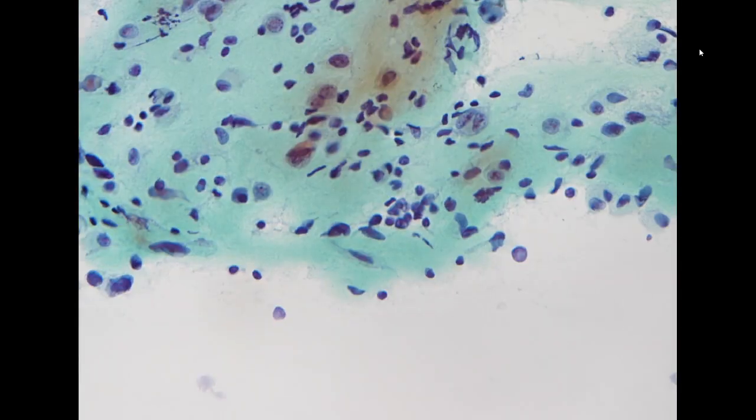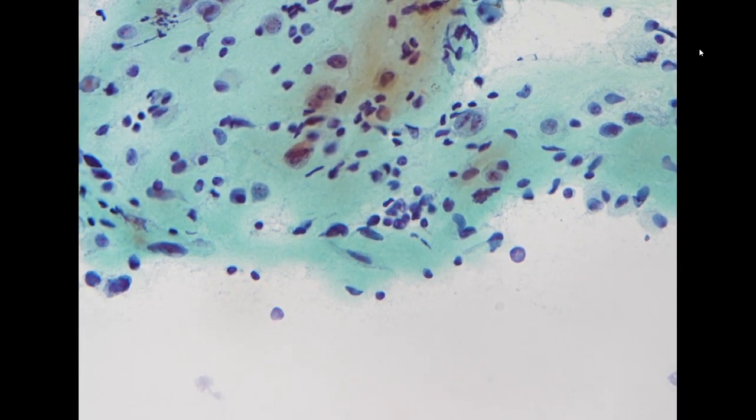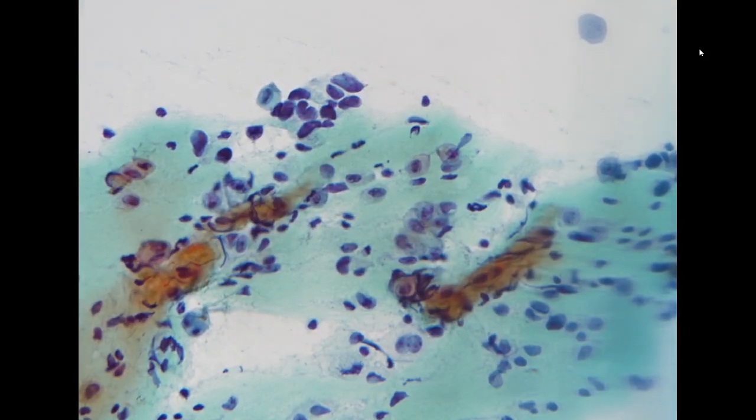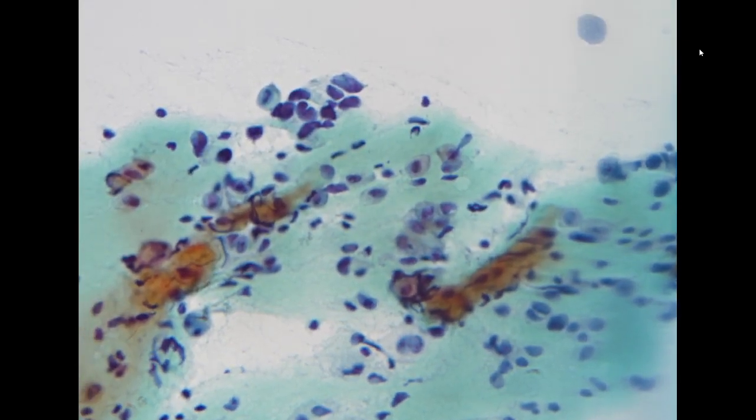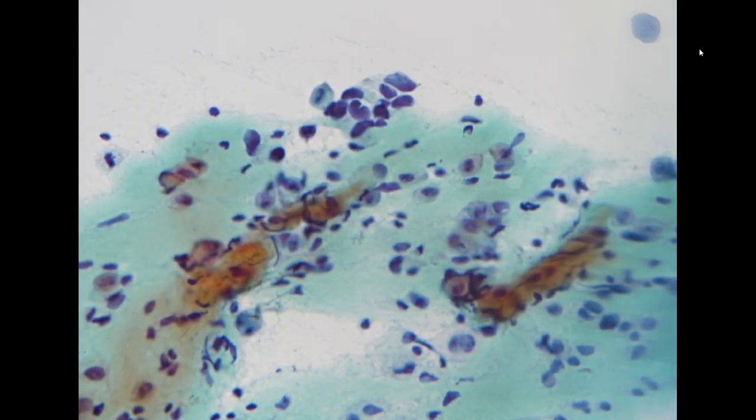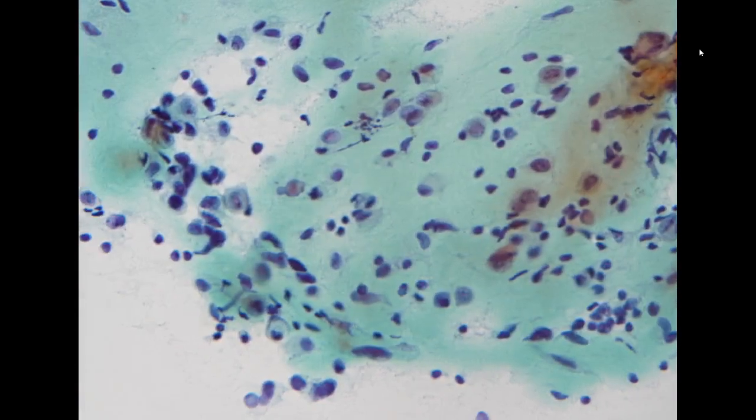I think at that time, probably on that day, the hematoxylin was very strong. So we do see these very dark staining cells along with a lot of extracellular proteinaceous material. So it's uncertain if these are the similar cells that we see just now.